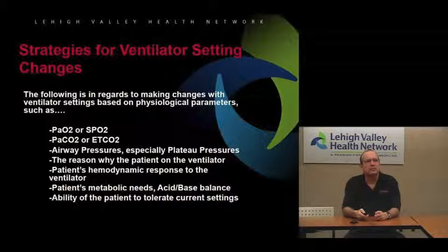Some of our strategies for ventilator setting changes. When we're thinking about making changes to the ventilator, you need to look at, do we really need to change them? If we're picking up a patient from somebody else's ER or ICU, and everything's in line just right, their SATs are good, their CO2 is good, whether you're monitoring your end tidal or it was good on their blood gas, their airway pressures, especially their plateau airway pressures, are good. You want to consider why the patient's on the ventilator, what put them on the ventilator, why they're still on the ventilator, and their hemodynamic response to the ventilator.